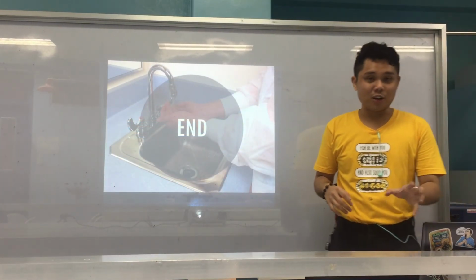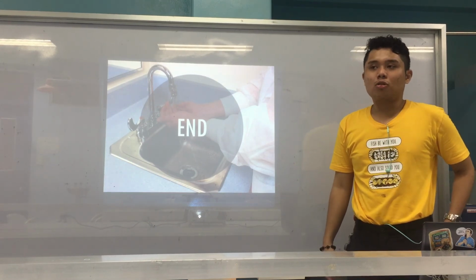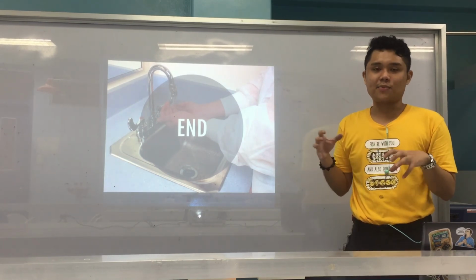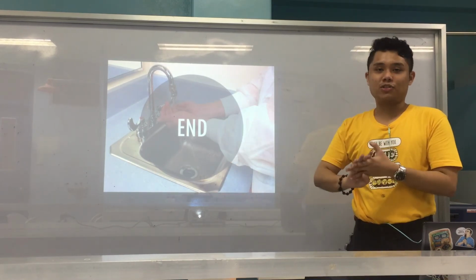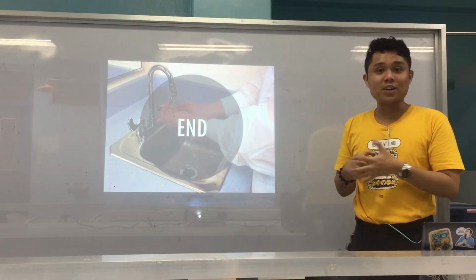That's all for urine culture. Alright? So, quite a straightforward discussion. So, the importance is the quantitation in urine culture because that is the basis for establishing infection, whether it's really significant or not. Alright? And the different urinary pathogens and our calculations. Okay? So, please take note of those. Alright? So, again, that's all for urine culture.